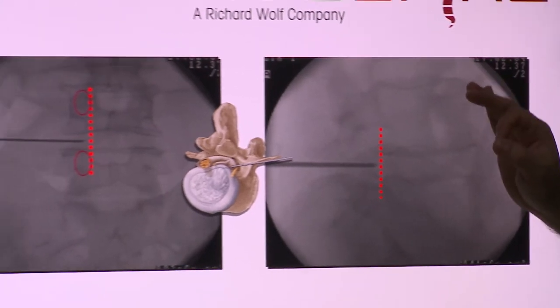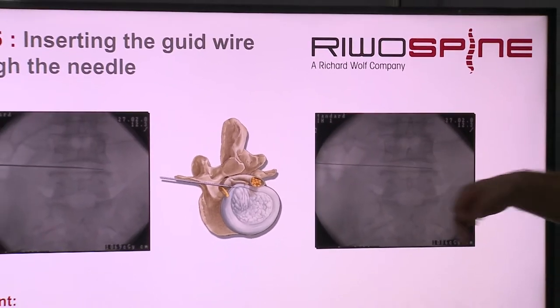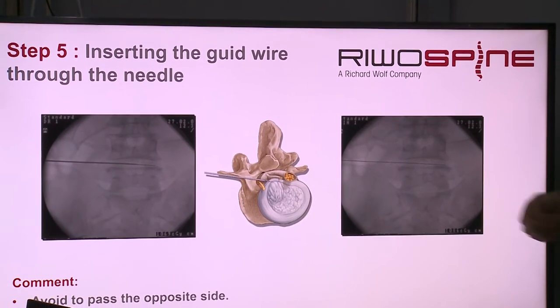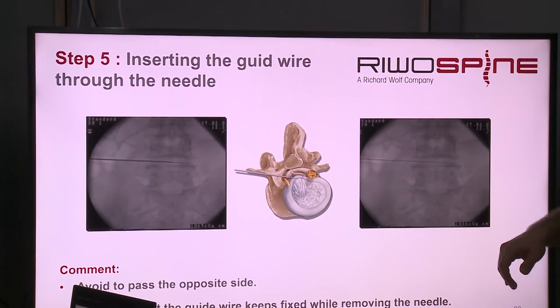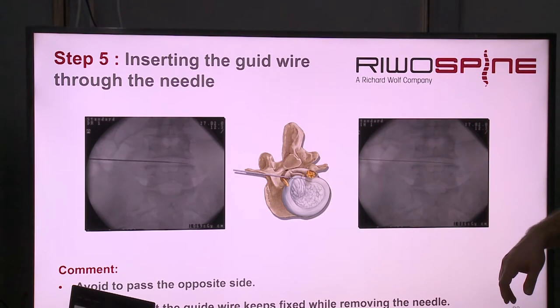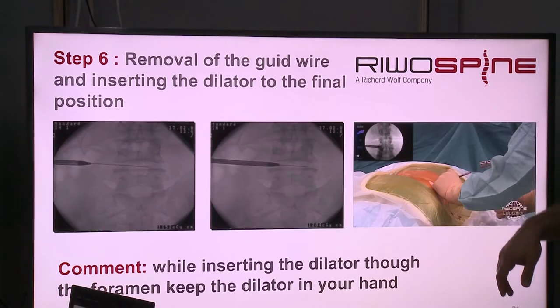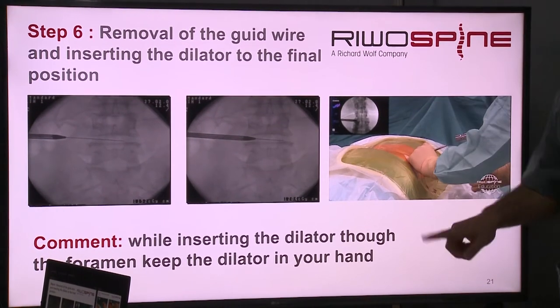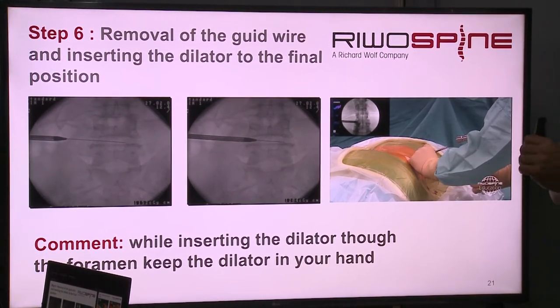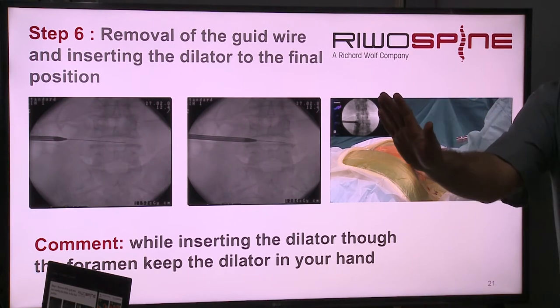When you place your needle here, then we remove the mandrel and guide wire inside. Then over the guide wire, we insert the dilator directly. And then with the hammer, we advance the dilator inside the spinal canal.